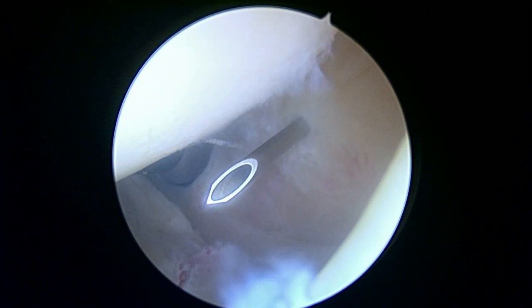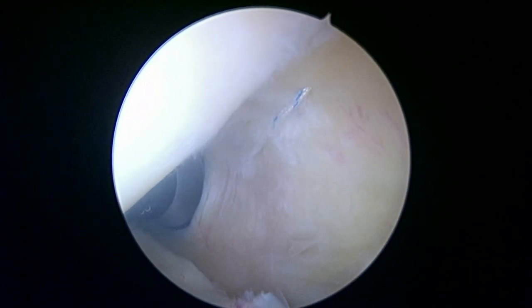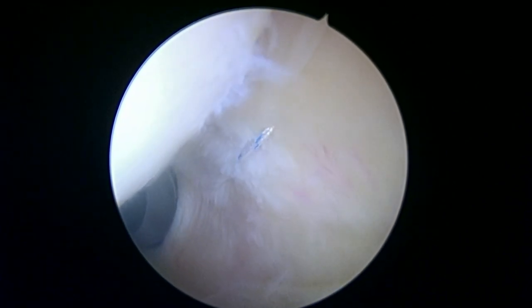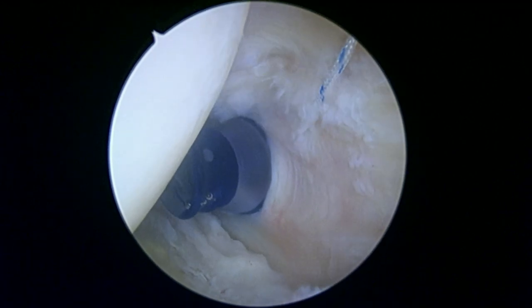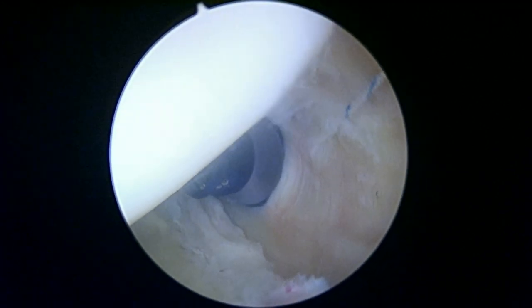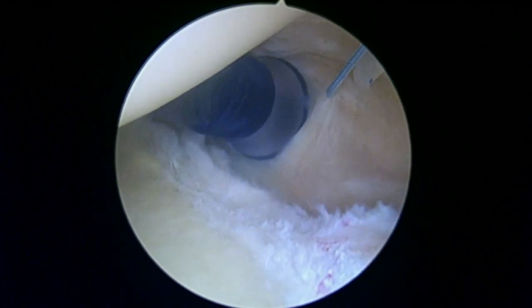You can see with that permanent suture — this is a very strong suture — how it's going across that split. That'll keep the split from getting worse, and if we have to actually add an anchor to this we certainly will. But this will allow us to find this area very quickly on the other side. We've passed our two rip stop stitches and now we're going to go look in the subacromial space after we do a little bit more cleaning up on the labrum.